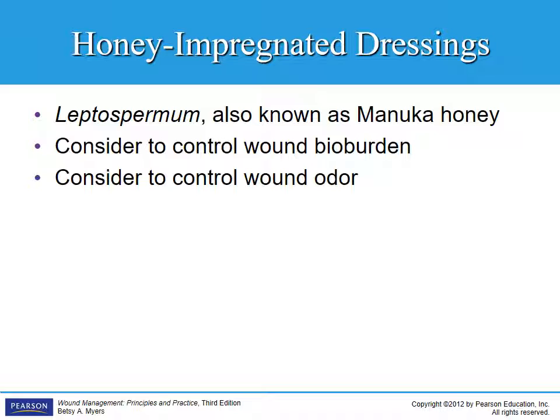Honey impregnated dressing, and it truly is honey. It's a Manuka honey. It controls the bioburden. There is some good research on this, and it will control bioburden, and it will also control a wound odor. So there are a lot of honey impregnated dressings that are out there right now being used quite a bit.